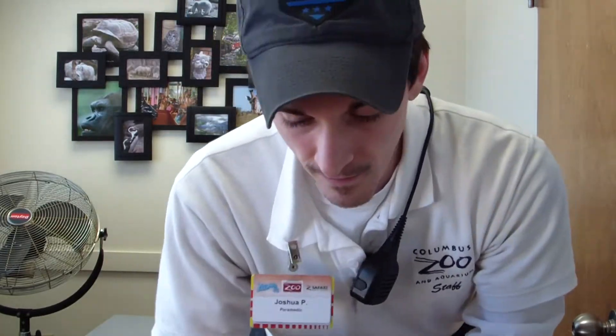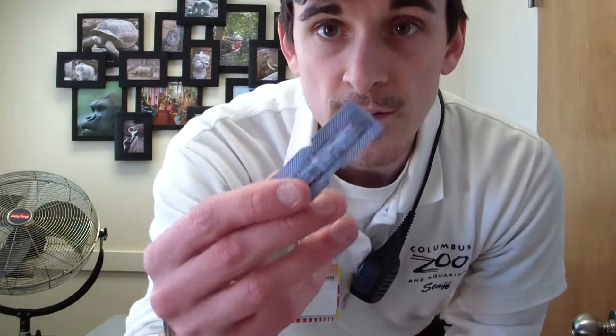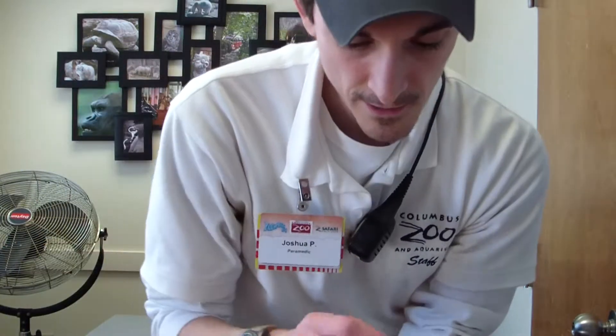So things you're going to need are some glucometer strips, a glucometer, a lancet — which is a spring-powered unit with a needle inside — and you're going to want a band-aid, some gauze, and some alcohol preps also.